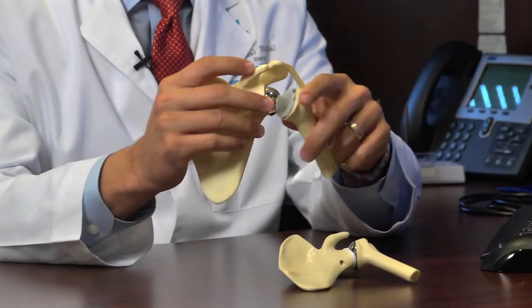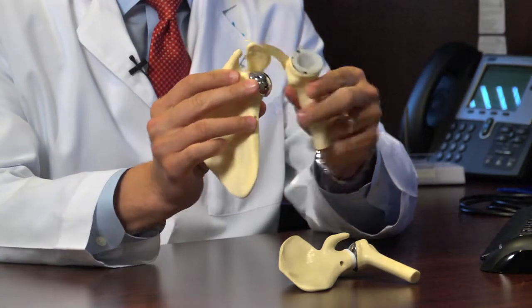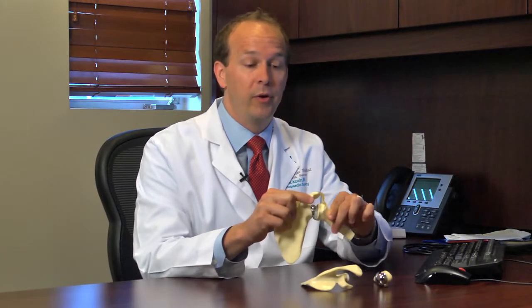Patients with a rotator cuff tear don't have that rotator cuff to balance. So what we've done is reverse it, and that's become the name of the implant itself. So instead, now on the humerus you have a socket, and on the shoulder blade side the ball is placed. That is a much more stable construct so that in rotator cuff deficient shoulders, they now have the ability to still lift your arm and most importantly have a stable shoulder.